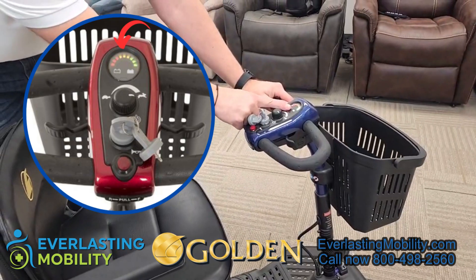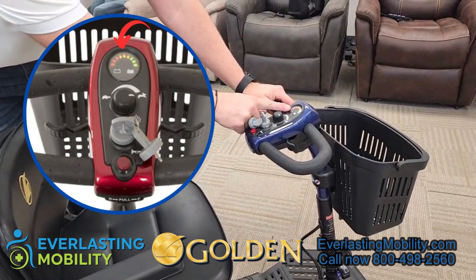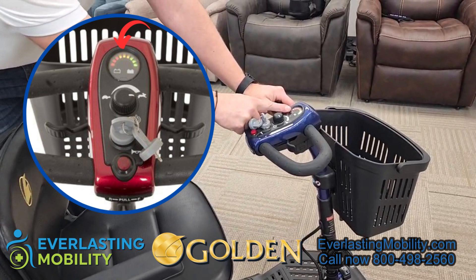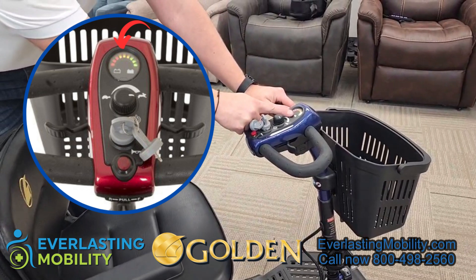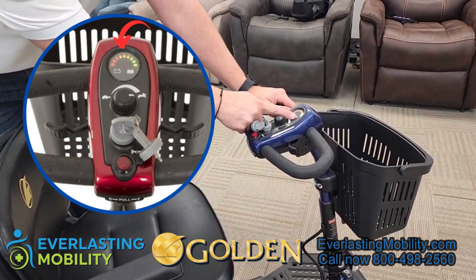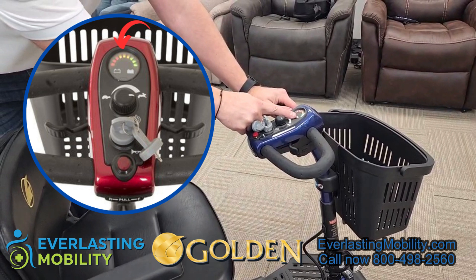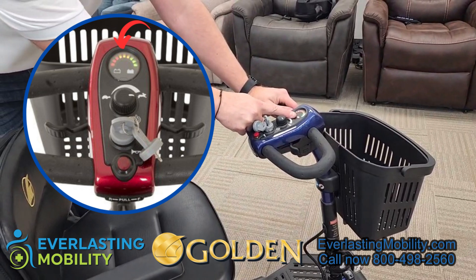There's also a front headlight that is adjustable, which is great for riding at night. On the tiller there is a battery gauge — each light on the gauge will disappear as the battery depletes. Once it reaches about halfway, we recommend recharging, and if you're good about doing that you can increase the lifespan of your batteries. That's a great tip we like to tell our customers.